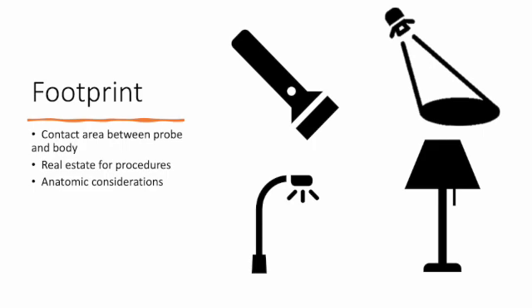So if we're working in the chest wall, we have the ribs that we need to worry about. And so a big bulky probe like our curvilinear probe is going to have to interact with all of those ribs to be able to get an image. And so we'll have to consider that when choosing which particular transducer we want to use for an exam.